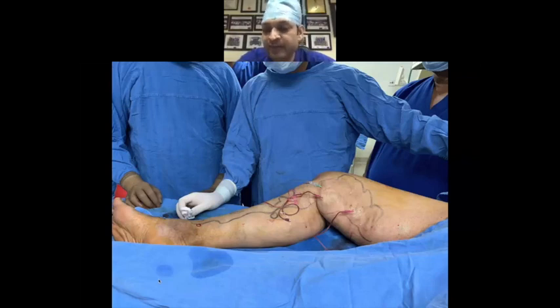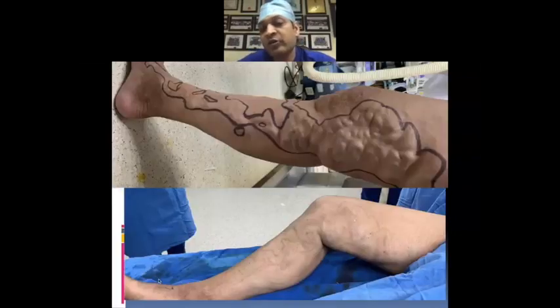Now it takes time. It takes around 10-15 minutes to do all the setup procedures, put in like 4-5 scalp veins, give tumescent anesthesia, wash the blood out of them, and then give the 3% foam. What happens with that is the requirement of foam becomes very low. So if you can imagine such big varicosities, you will use around 12 to 15 ml foam. That's all, and you can get such good results on the table.